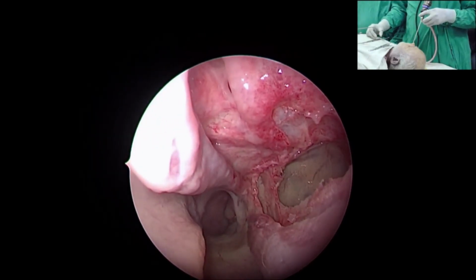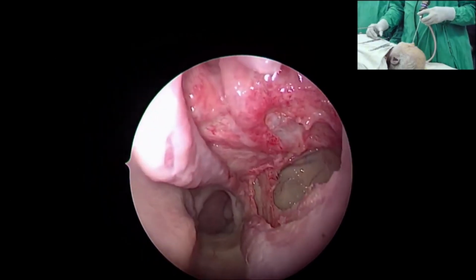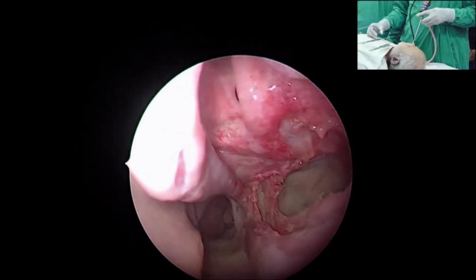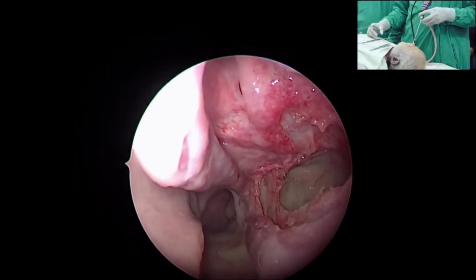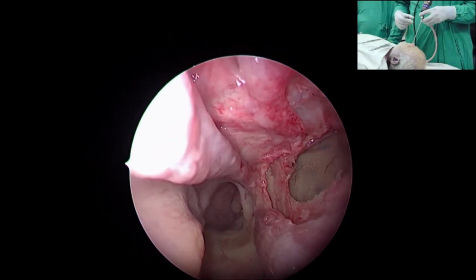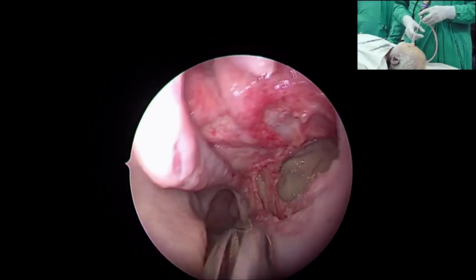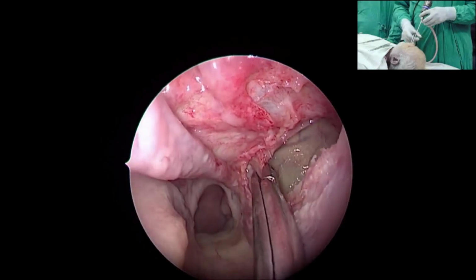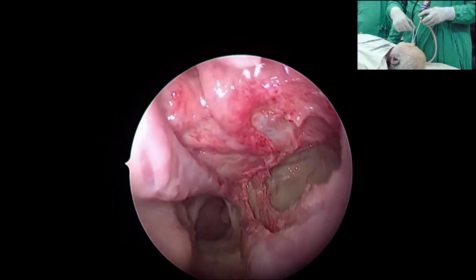All those things together, along with doing these procedures in the reverse Trendelenburg position, we're able to get a good optimized field rather than infiltrating and giving unnecessarily an opportunity for the adrenaline to spread in the systemic circulation and give complications. So we don't infiltrate for that matter.